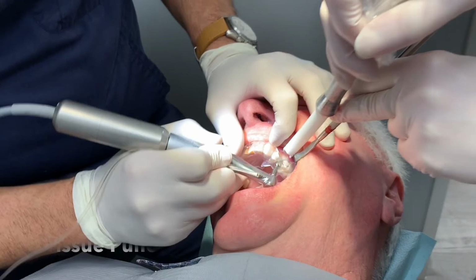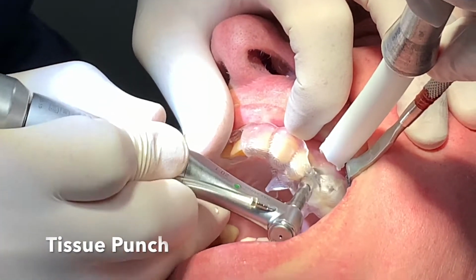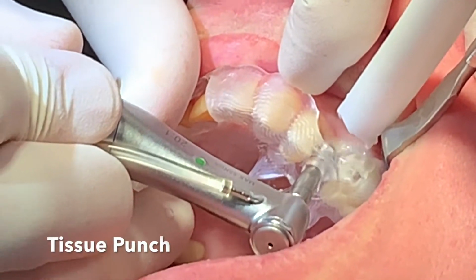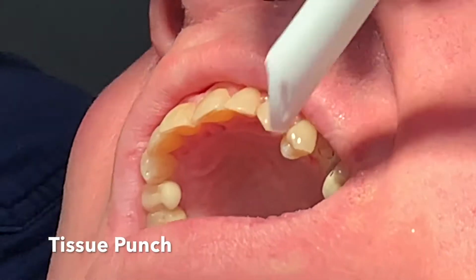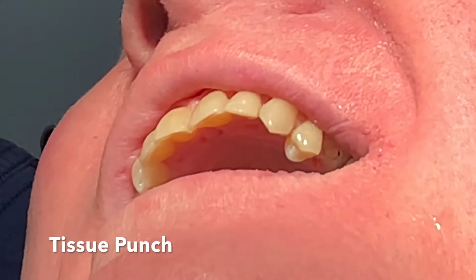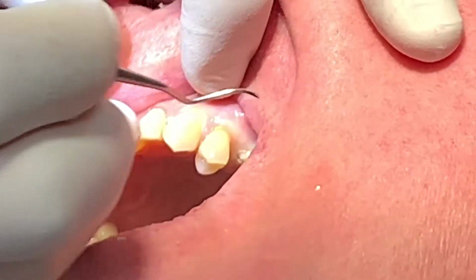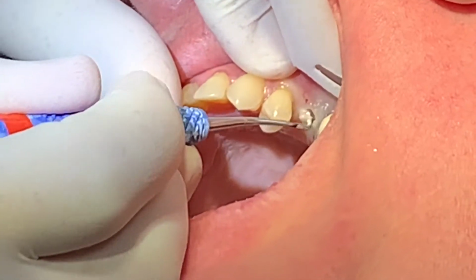All right. Tissue and a lot of bone. So we're just punching the tissue here, and I like to kind of do a figure 8 motion with my punch just to make sure I got it all. Okay. Spin your head towards me. Yeah, it's really loud.